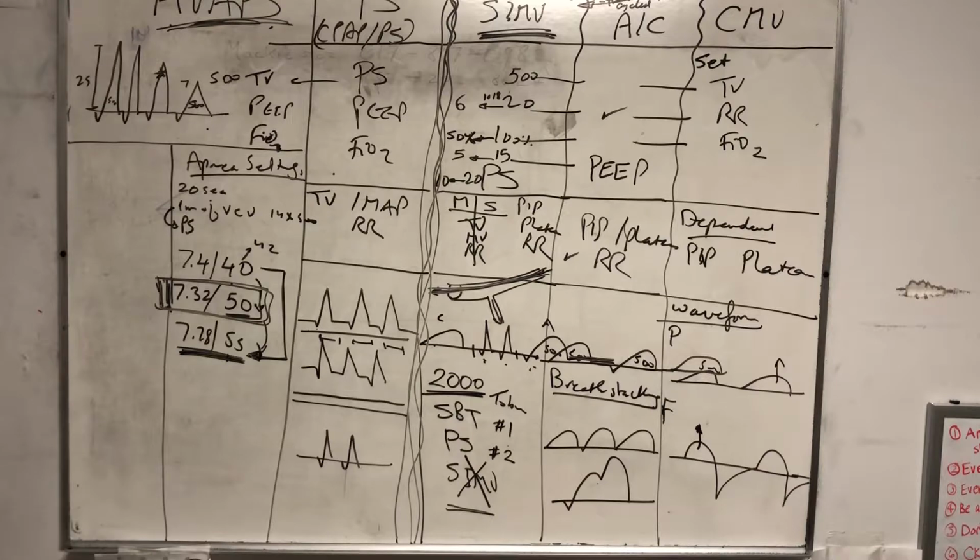One of our respiratory therapists here just likes to squeeze. He just likes to fold the vent. So keep squeezing the vent tubing, and the vent thinks that the patient is breathing. Or you can change the apnea settings to 60 seconds. That's the least preferred, because this will remain the default for the next patient. So, whatever you do, just let the patient breathe. I can make anybody breathe as long as they're awake. Okay, so that's your apnea settings here.